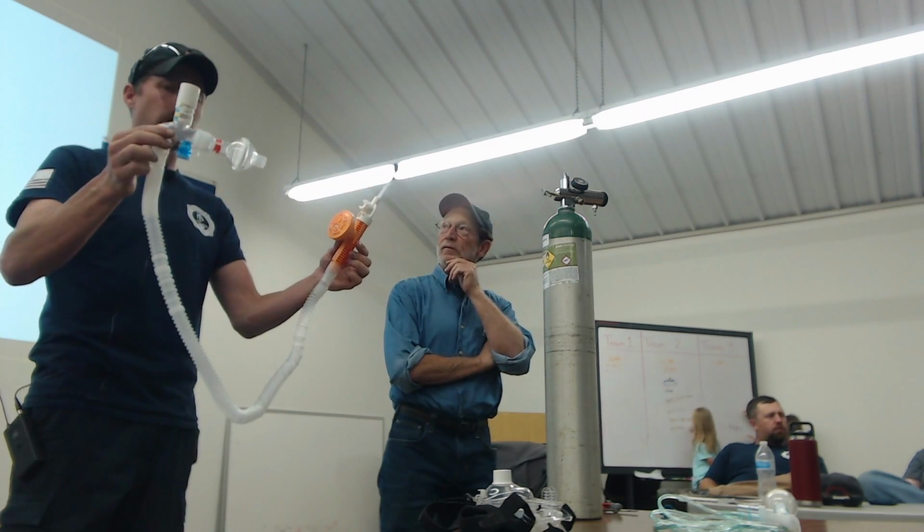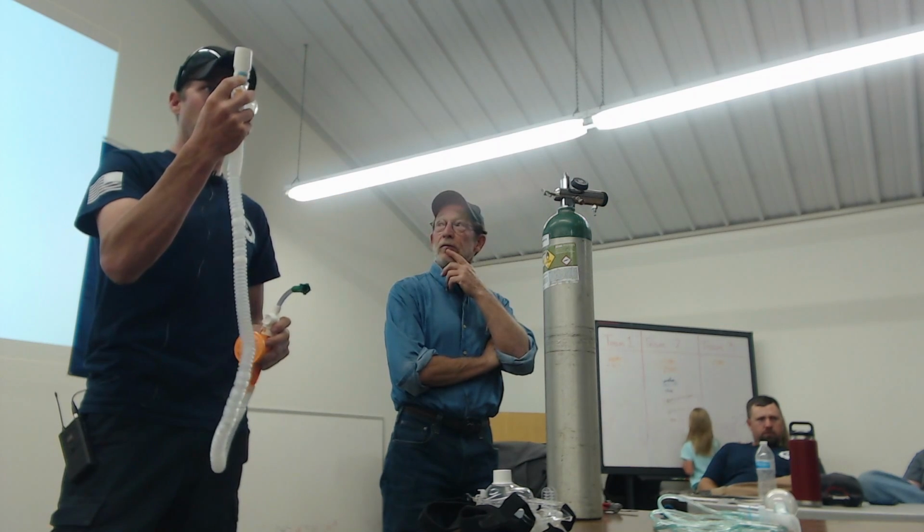On the flip side, the way this particular unit functions, some units, if you change the PEEP pressure, it will change the demand of the amount of flow it's using out of the bottle. This particular system does not. So if you choose to change the PEEP pressure, you will not change the consumption of the oxygen. So just know that. With this system anyway, I would definitely max this out before you start considering this.